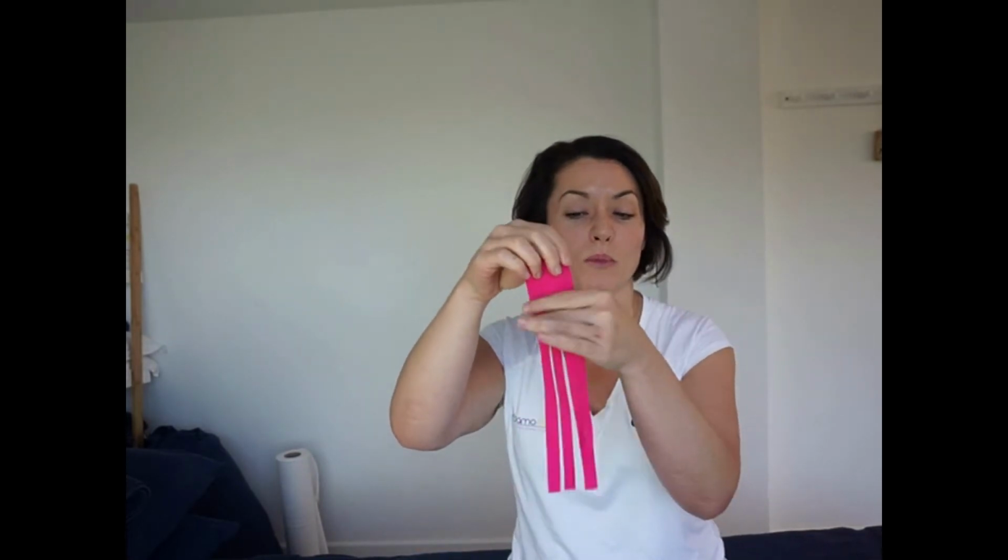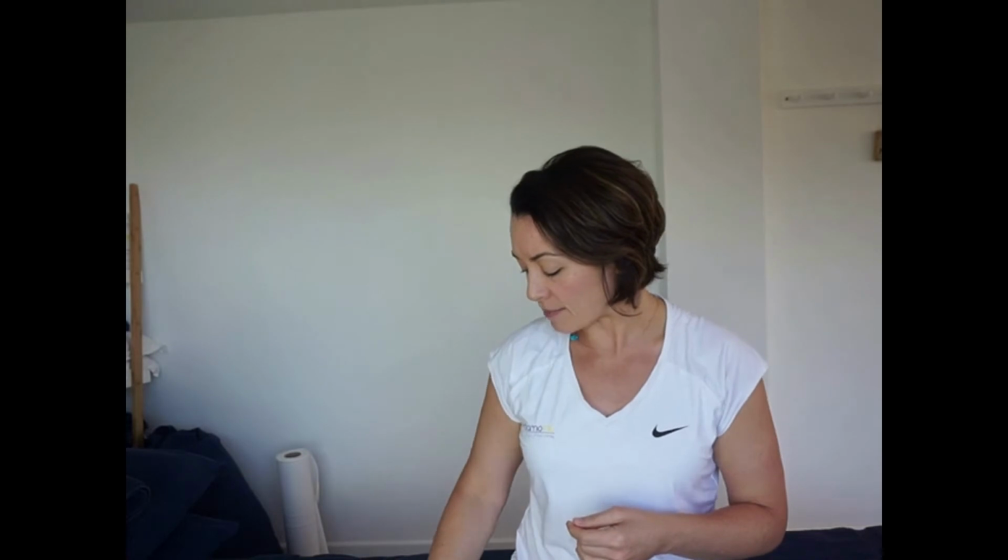The key thing we need is a sharp pair of scissors as well when we're doing tape, because we need to trim tape. Okay, so you will see us throughout the modules, throughout the different tapings, creating things like this, which is more of a fan shape with the tape. You will see us rounding edges, really important in terms of not catching the tape, so helping with its durability as well. So you need to consider the type of tape you purchase, the quality of that, the different widths, and also making sure you've got good sharp scissors so that you can cut it quickly, you can cut it without fraying, and you can also round the edges quickly to help with the durability.